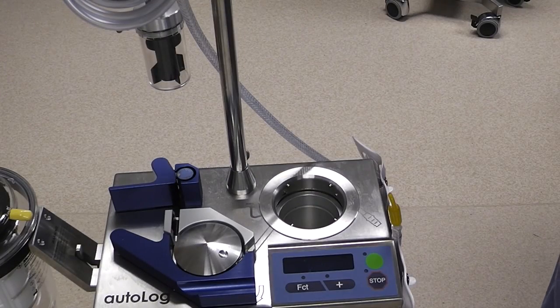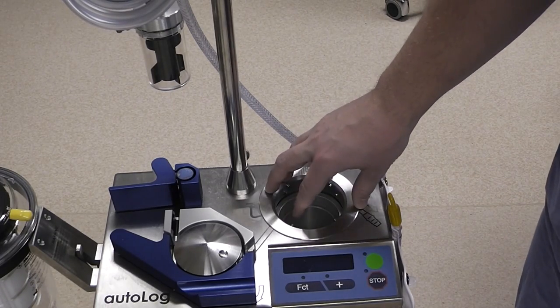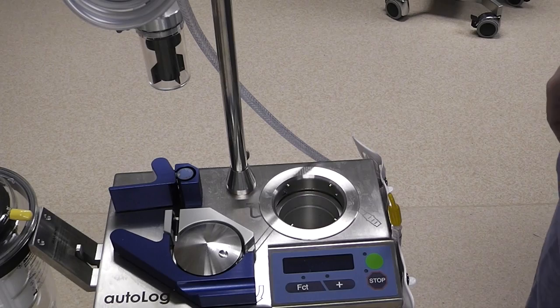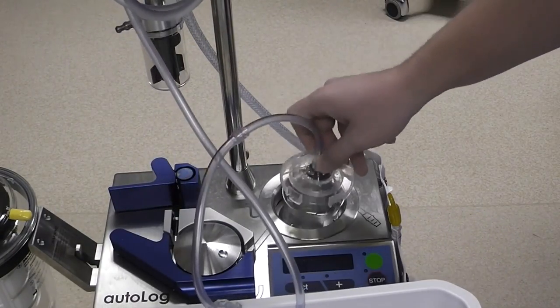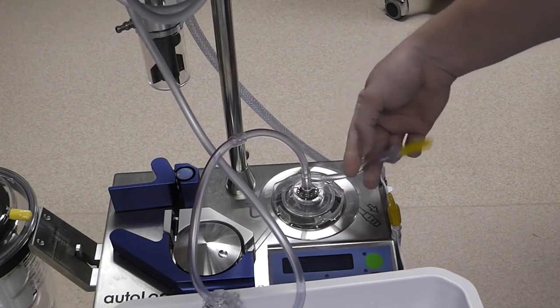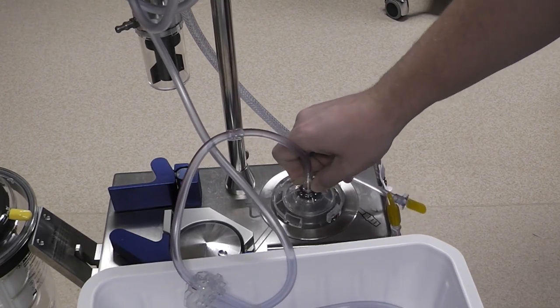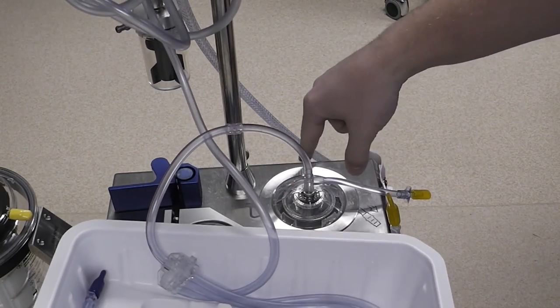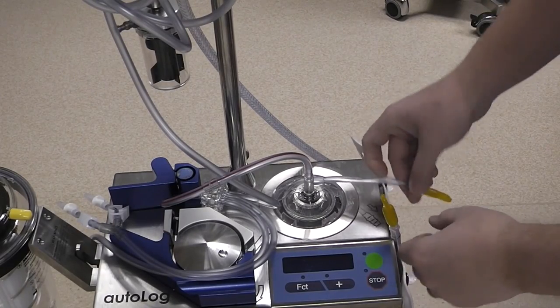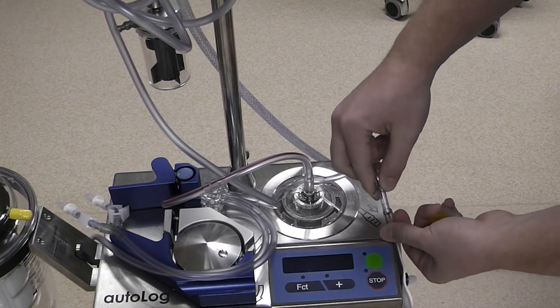Next we are going to insert the wash bowl into this chamber on top of the cell saver. Before we do that we want to note these four pins on the sides of this chamber which correspond to some slots on the side of the wash bowl. We will take out the wash bowl and insert it into this chamber with the line with the yellow cap facing towards the right of the machine. We will find those slots, push it down, and give it a clockwise turn until it clicks. Then we will attach the line coming from the wash bowl with the yellow cap to the top of the waste bag.